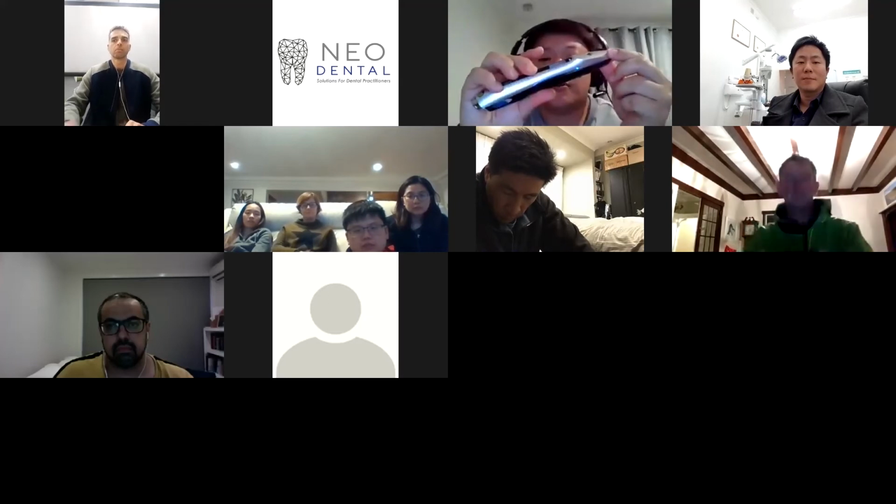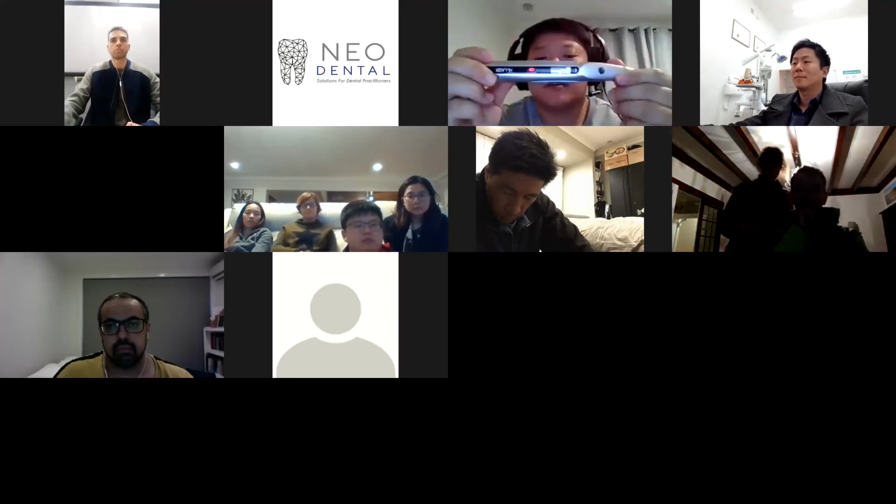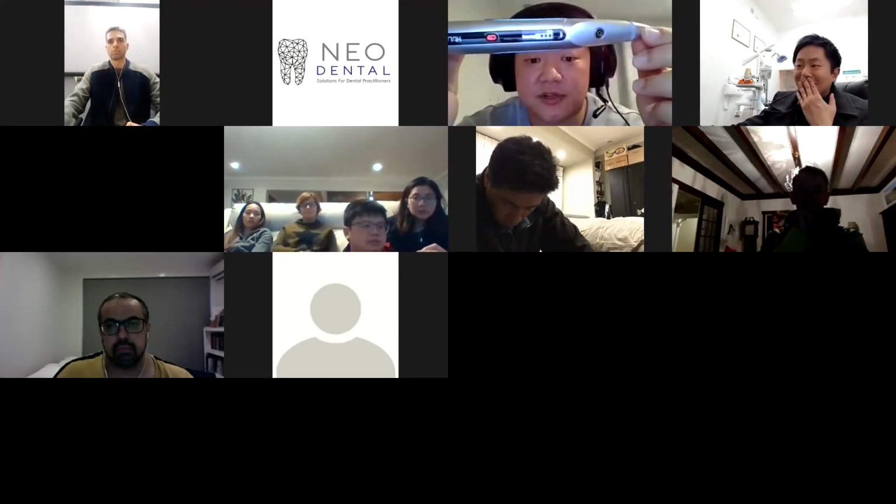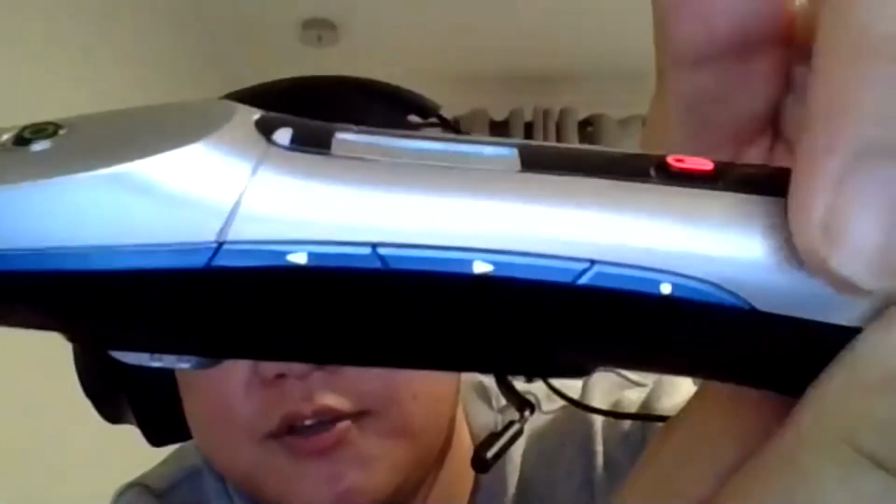When you turn on your unit, there's a nice welcome sign. It's not very great trying to show this on a webinar, but when you turn it on, you'll get a prompt for a password. I've been told that a lot of people get confused about it, but it's just a safety mechanism, as on most lasers, to prevent kids and people who shouldn't be playing with it. The code is actually just set as 0000. So you just push the button that's got the dot on the back, this button here, 4 times, and that'll log you into the laser.